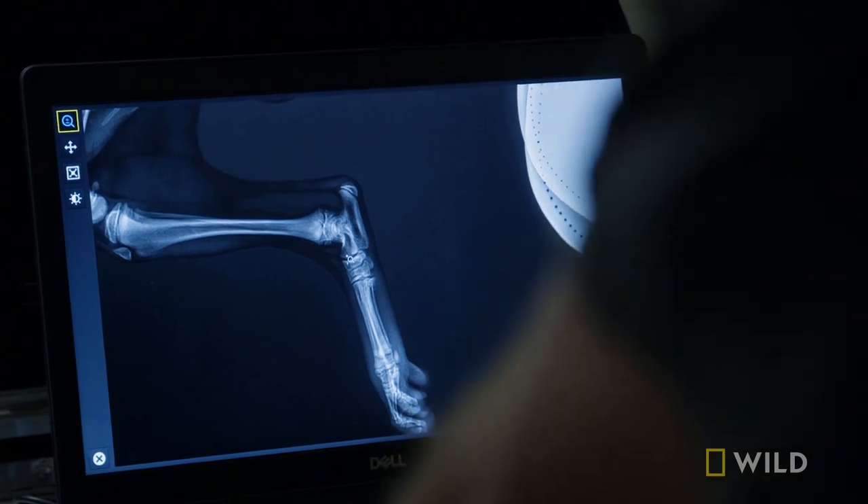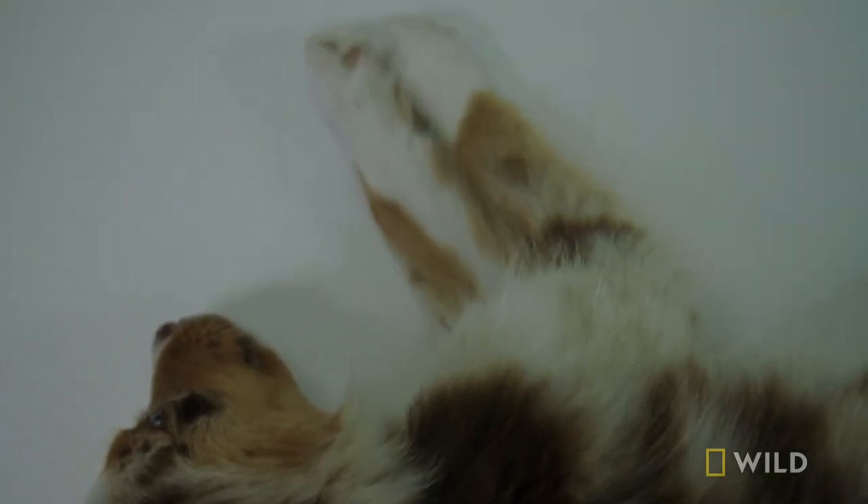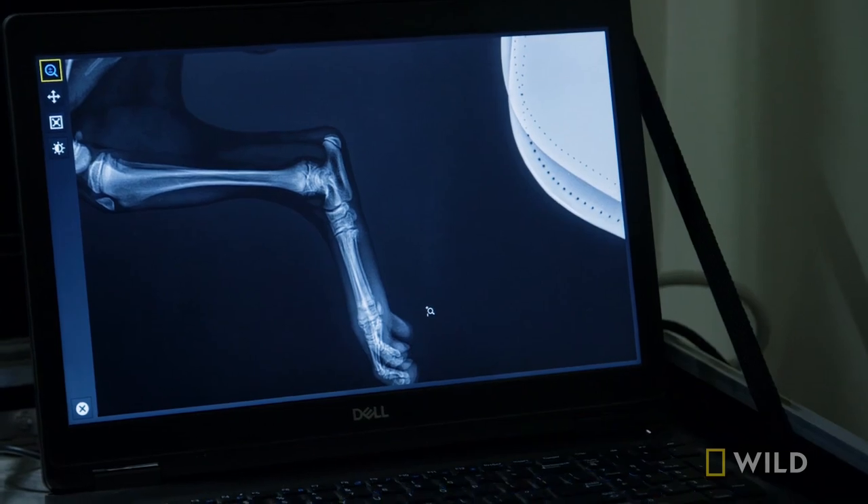We better take one from top to bottom. We need to make sure that there's not something I'm not seeing here. Knox is a puppy with a badly injured hind leg that he got while roughhousing with his owner's dad. This little guy's in a lot of pain, and he's not even using his hind leg at all.